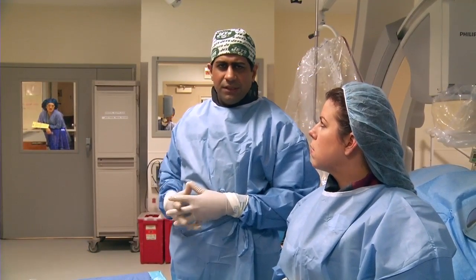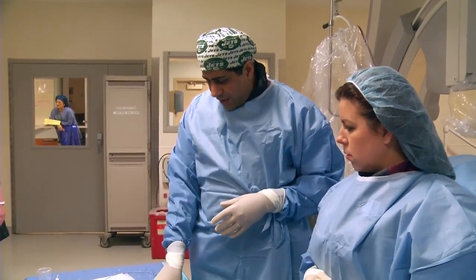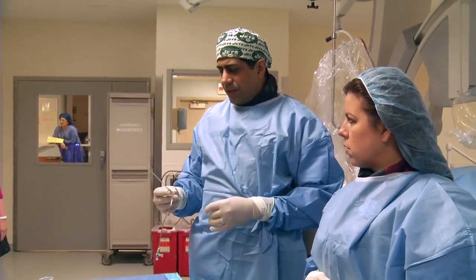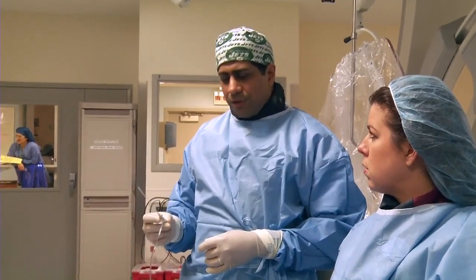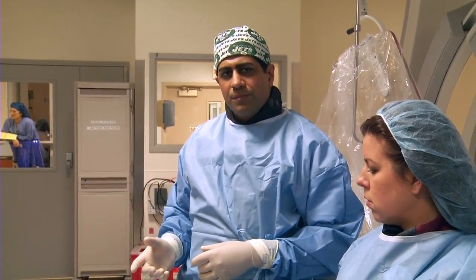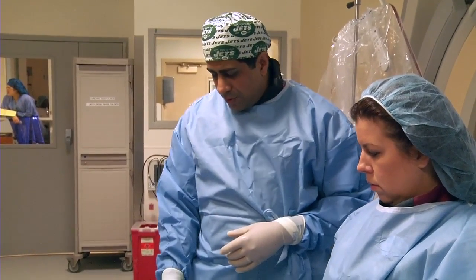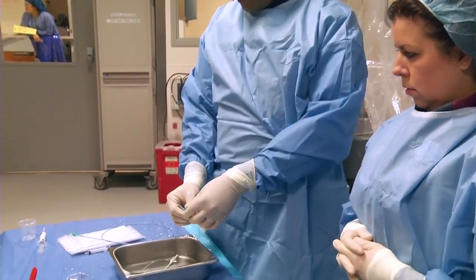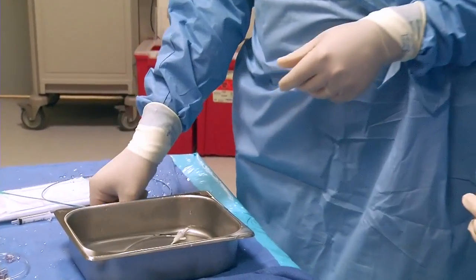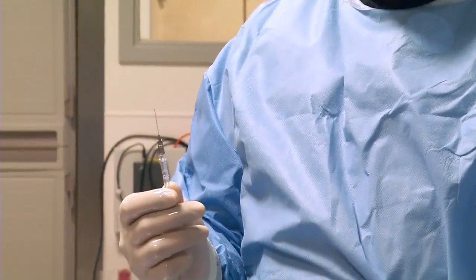So we do have specialized equipment made for the transradial approach. This is the Glidesheath catheter. It's got a hydrophilic coating, so it's important to soak it prior to use. This promotes a smoother insertion and decreases the chance of getting vessel spasm. We have a .021 glide wire that we're going to use to access. And the access needle we use is a 21 gauge angiocath.